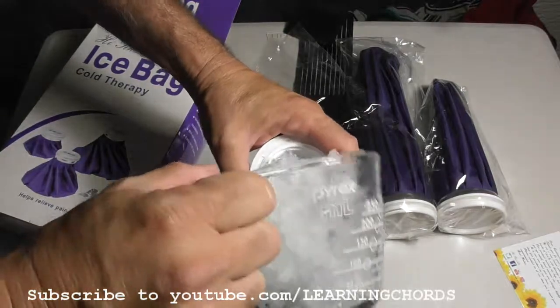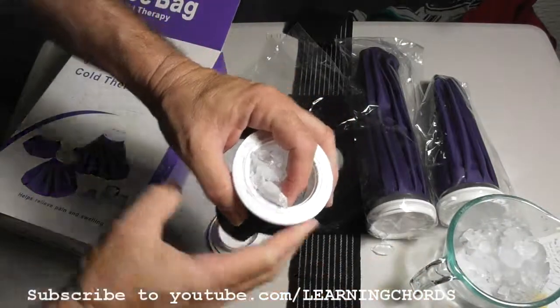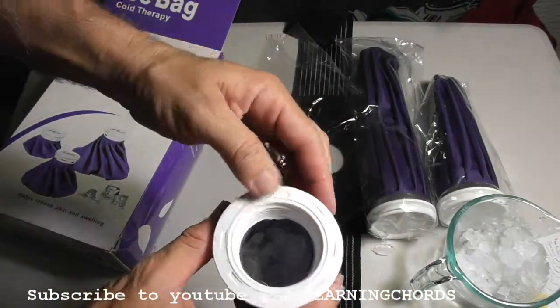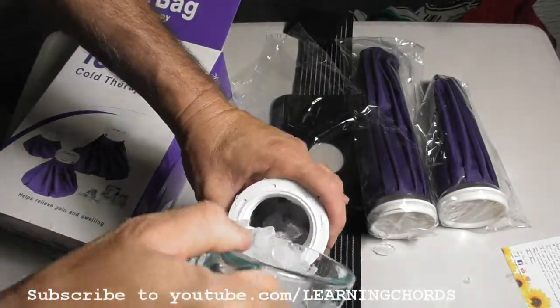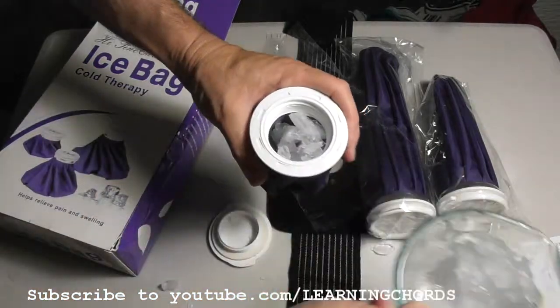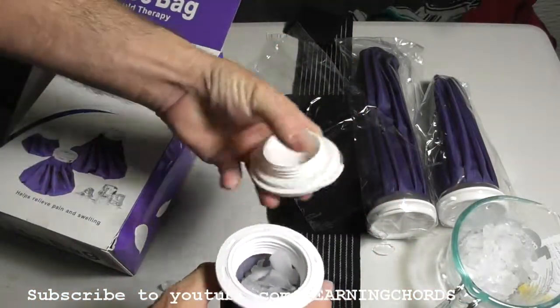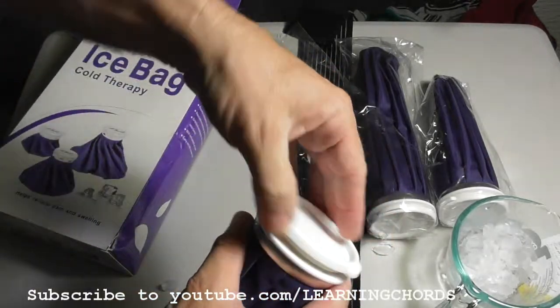I am a firm believer in ice for healing. Now I've always used heat — heat is relaxing and heat has its purpose — but ice is a little uncomfortable. You lay down, you put an ice pack on a sore part of your body, and in a couple minutes you are going to feel incredible.